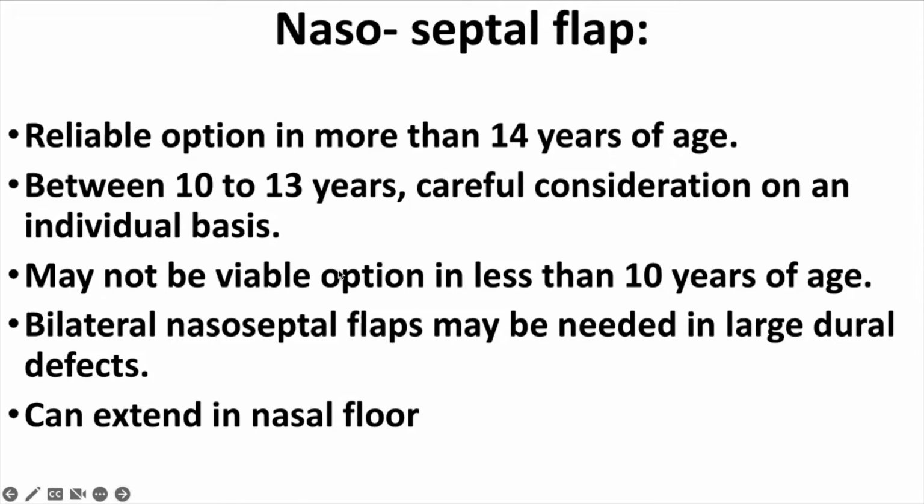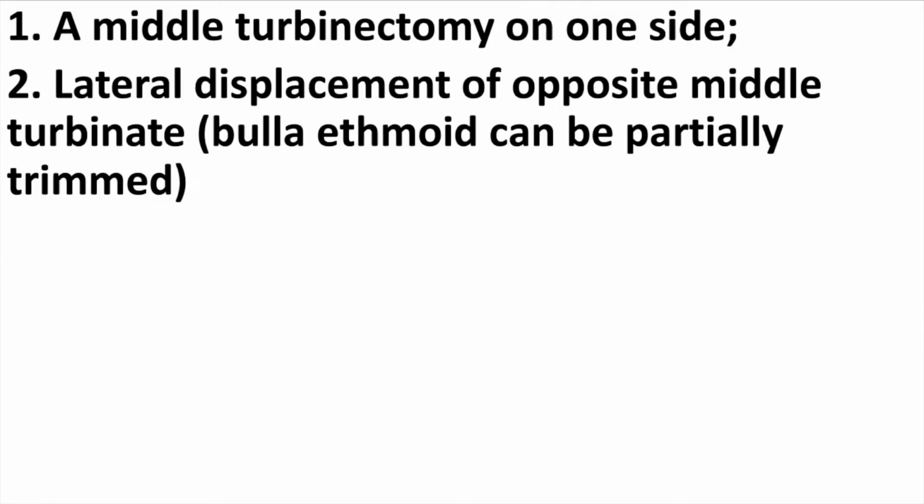Less than 10 years of age, usually this may not be enough, especially if the dural defect is large. So in such cases, you can take a bilateral nasoseptal flap, or you can extend the flap onto the nasal floor. So the width can be increased, but the length obviously will be short.